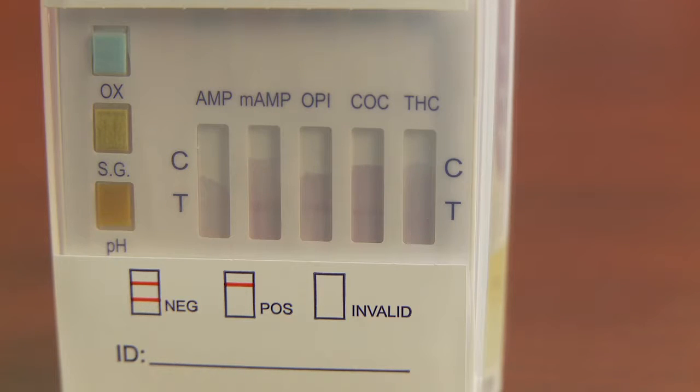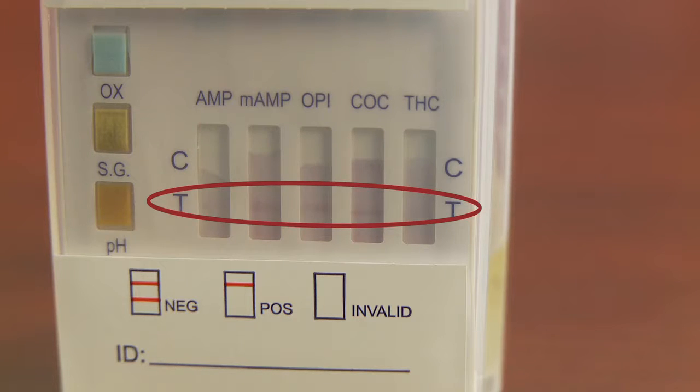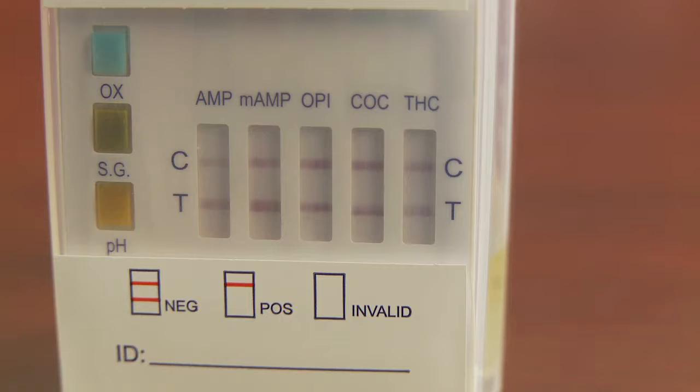To interpret the results of the test, look at the test result window. There will be a control region at the top of each strip and a test region at the bottom of each strip. A red line should appear in the control region to indicate the test has run properly. Interpret the presence or absence of a line in the test region to determine if a drug has been detected.